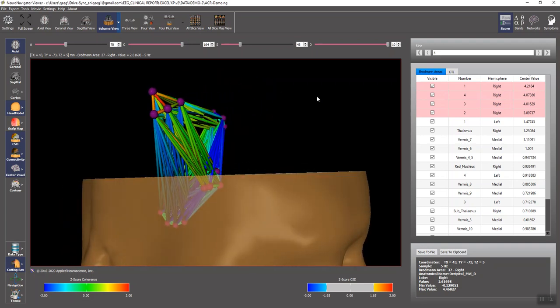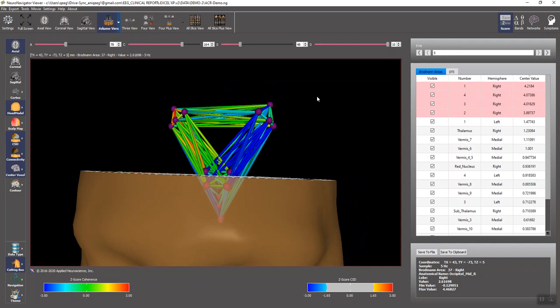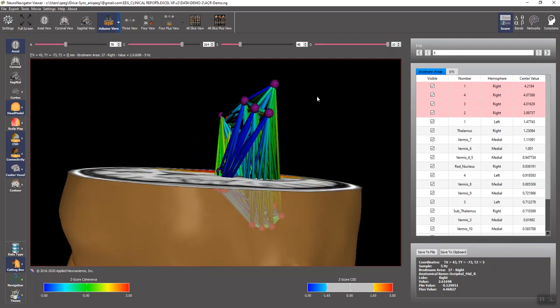One can then target this network, reinforce greater stability and efficiency.